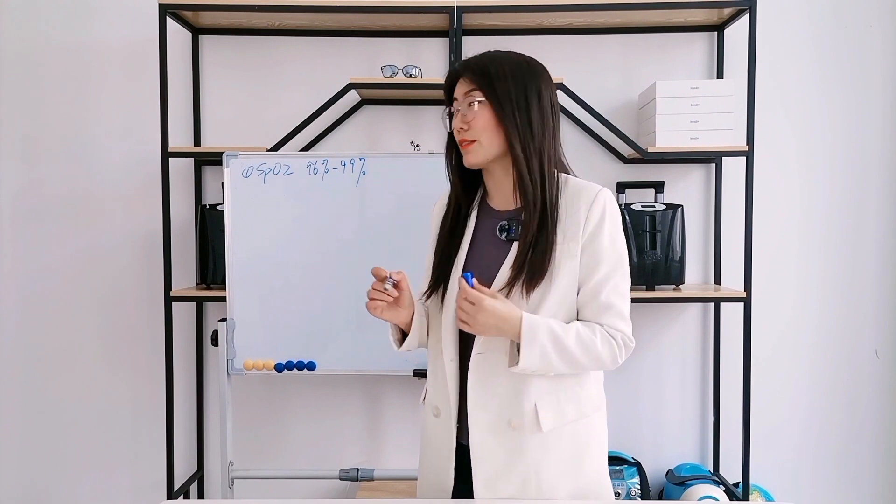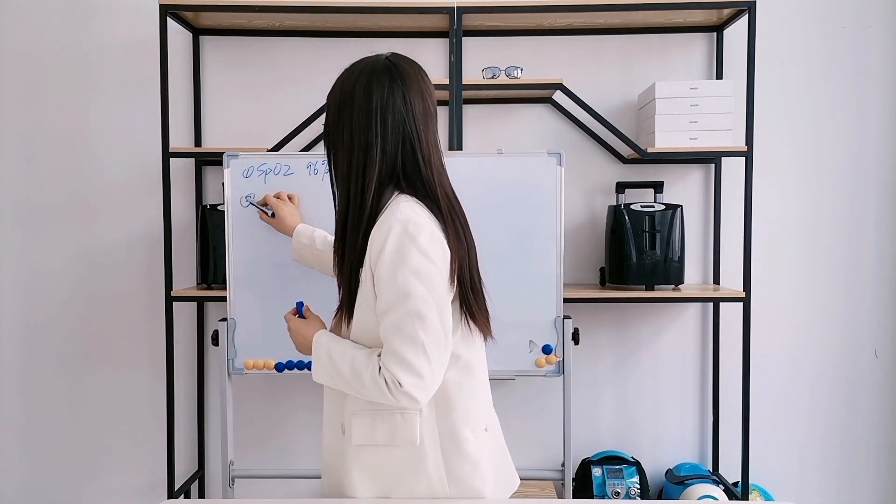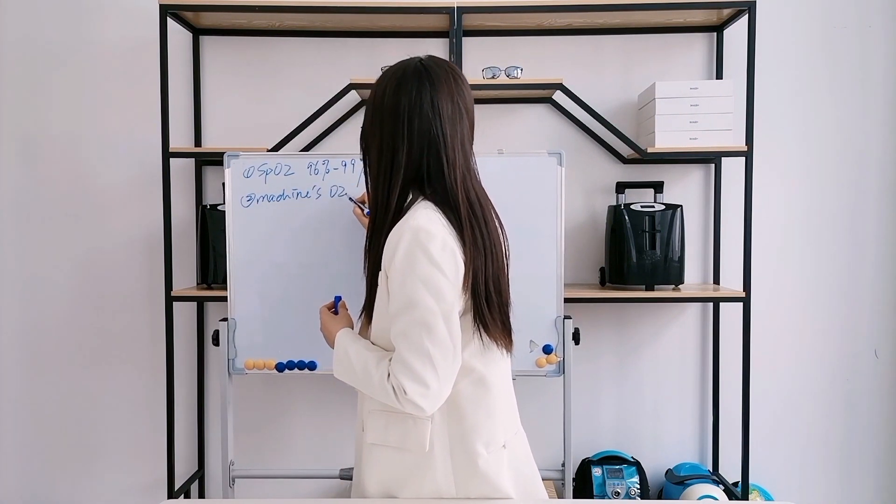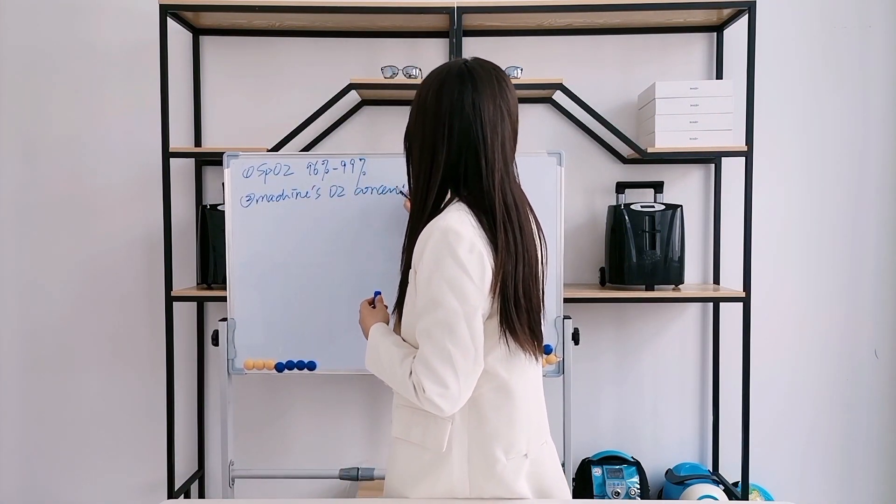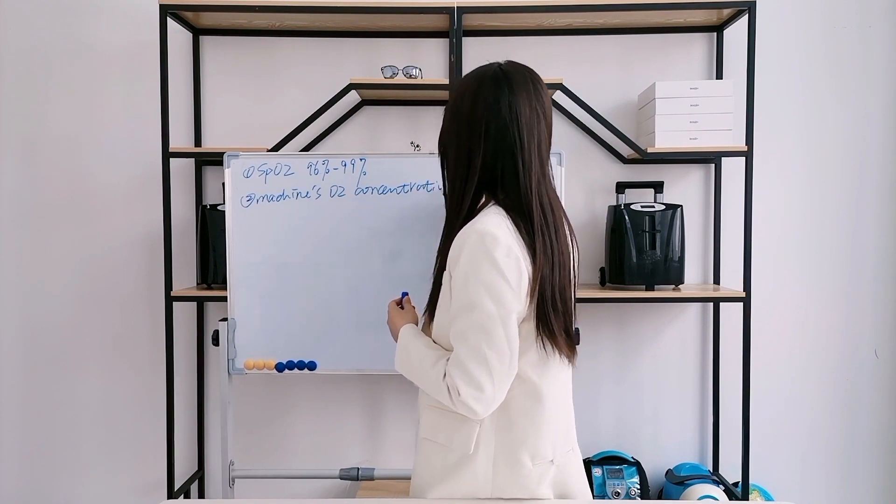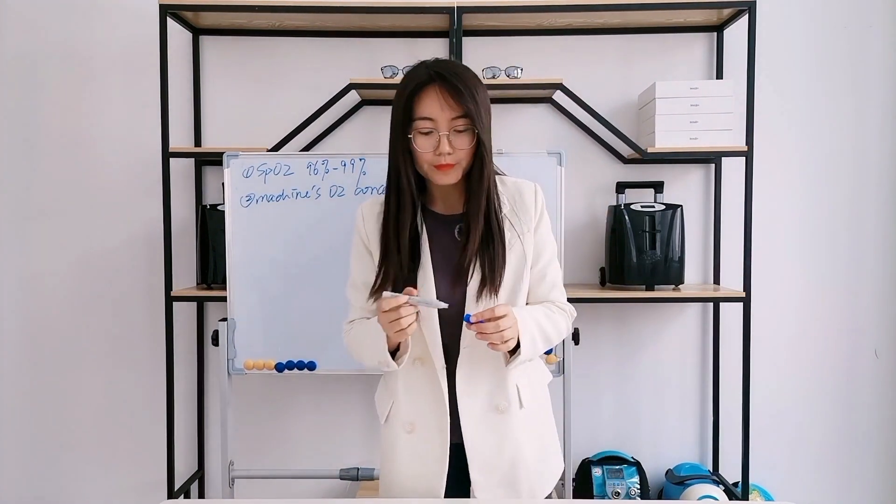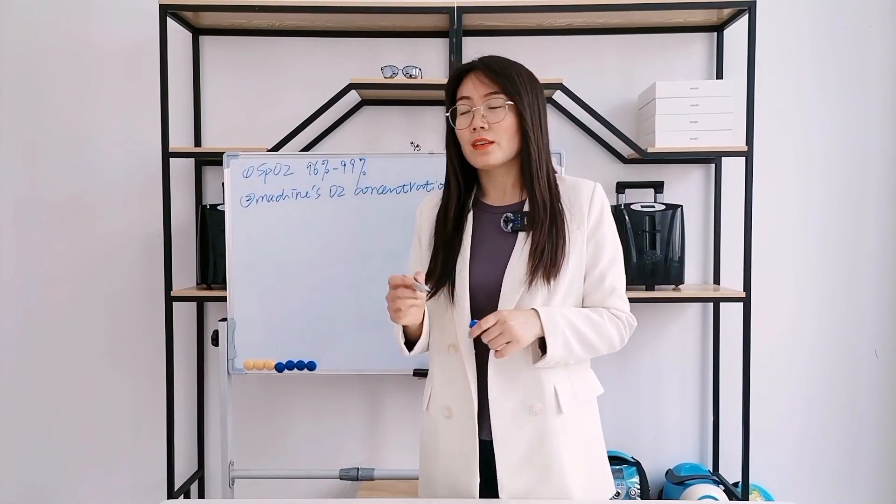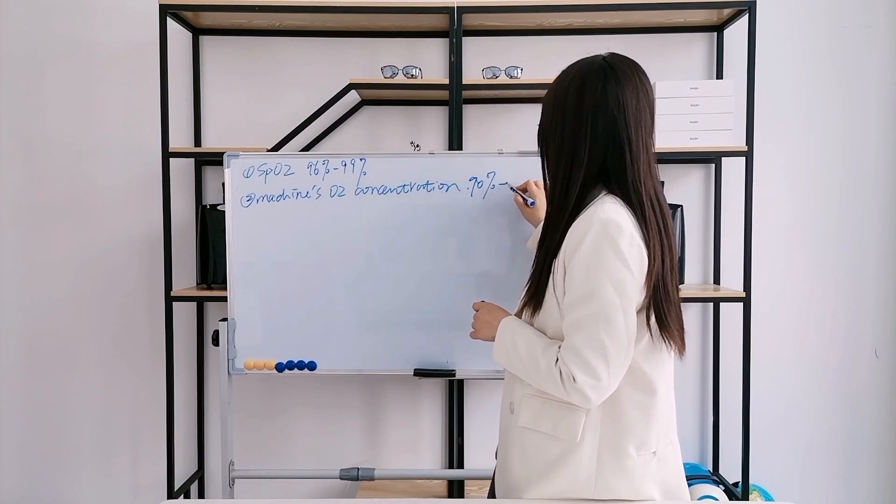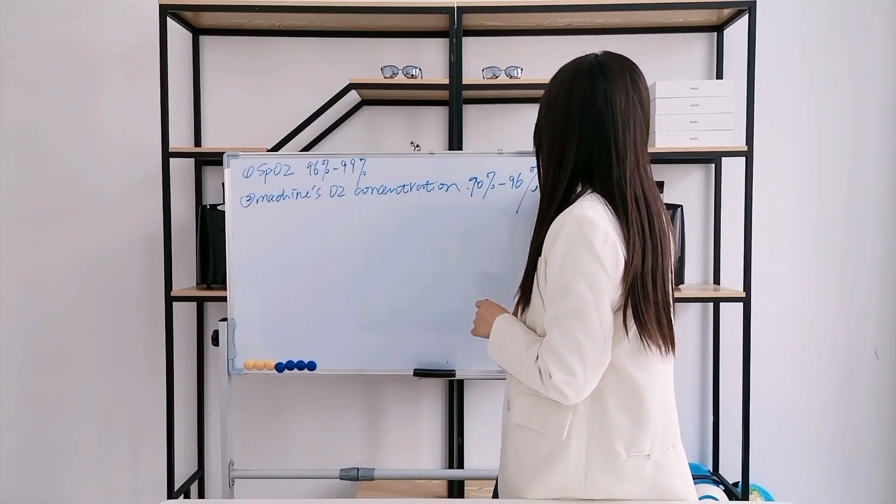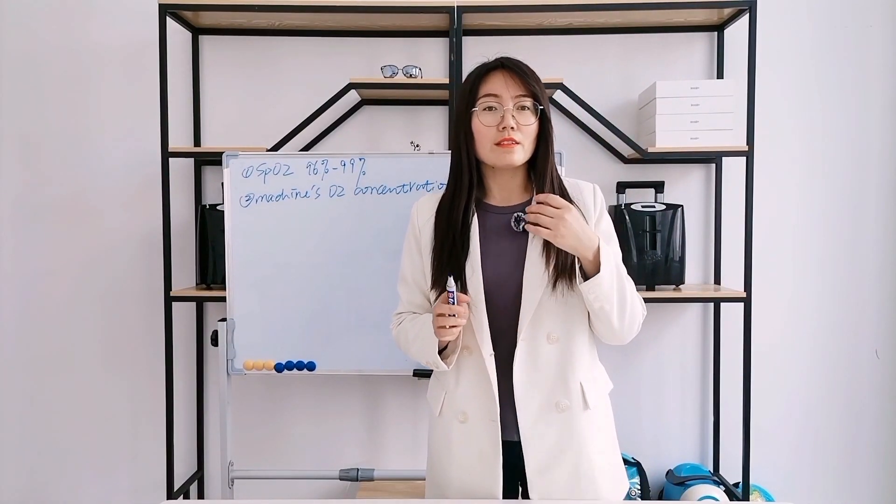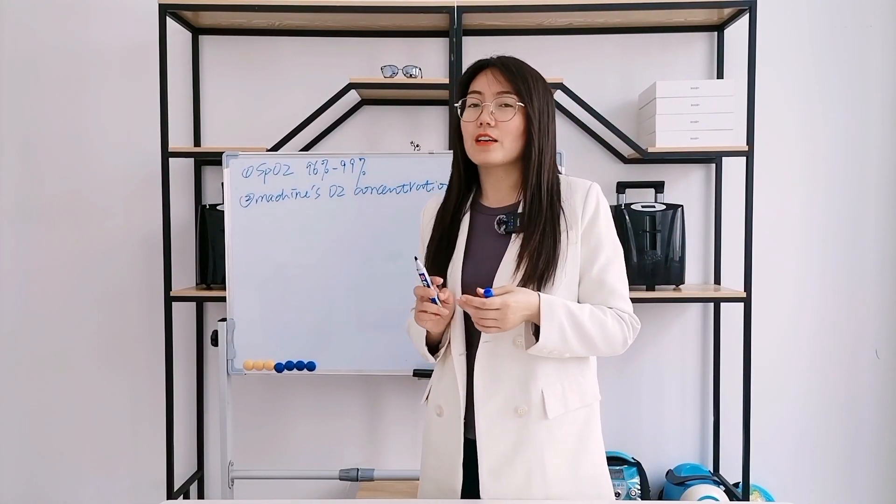The second one is machine oxygen concentration. Usually, a medical grade oxygen concentrator can produce 90% to 96% oxygen purity.